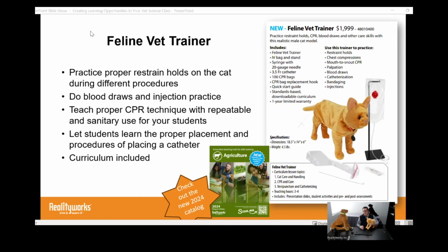This allows us to do it sanitary, as we have the ability to use a bag that the student can place over the snout, that works with the body, so they can actually see, are they getting that chest to rise or not? Are they able to do a mouth to snout resuscitation? And then also being able to make sure that they're putting their hands and doing the technique correctly. Lastly, we have the ability for them to do catheterization.